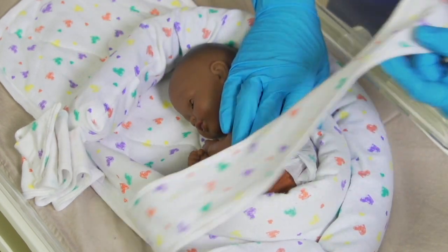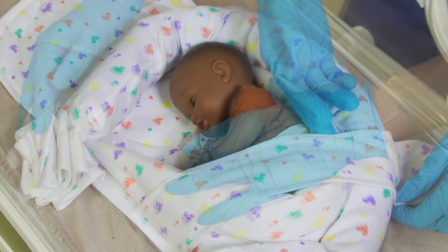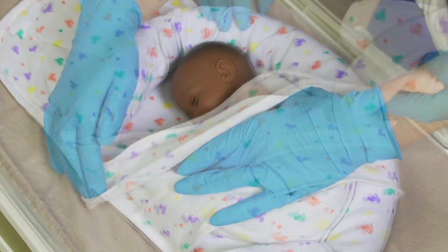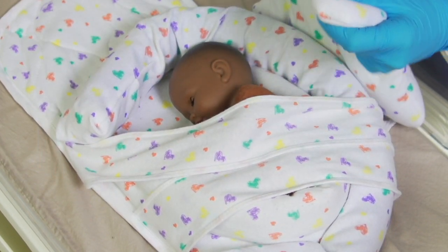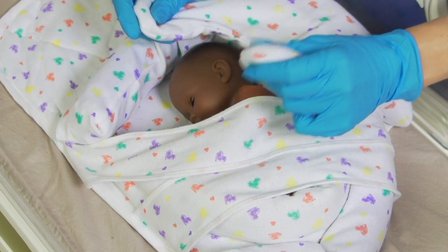Adjust the straps to provide containment, while also allowing for dynamic movement at the hips first, then the shoulders. Follow the infant's cues. In addition to the bendy bumper, you may add a Frederick T. Frog to enhance stability and containment. Do not place the Frederick T. Frog's full weight on the infant.